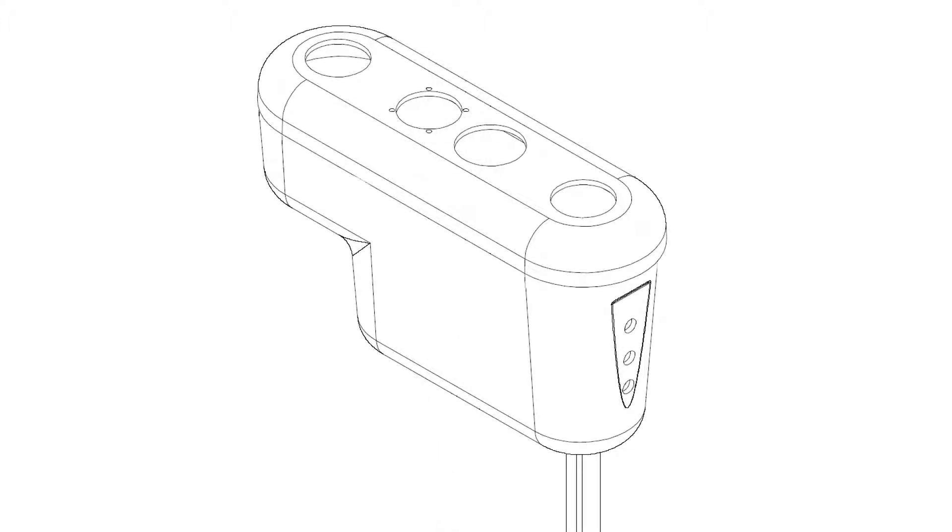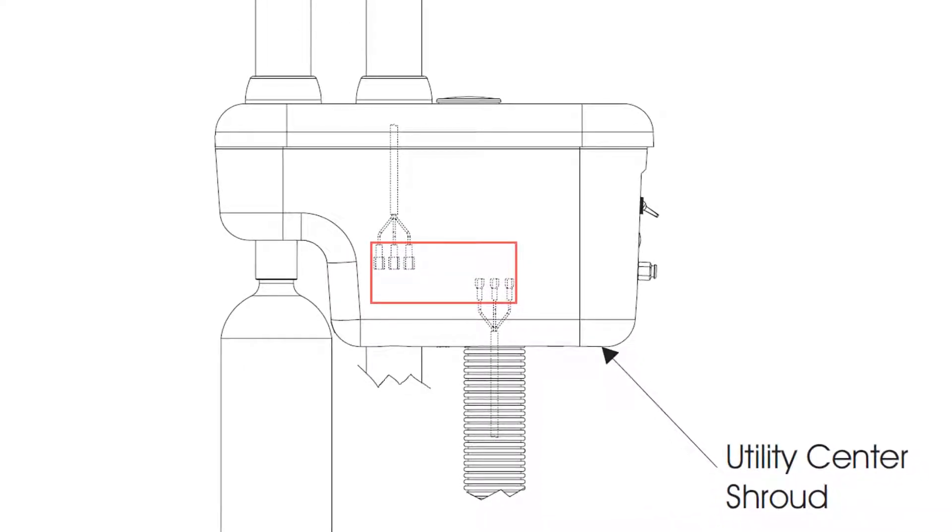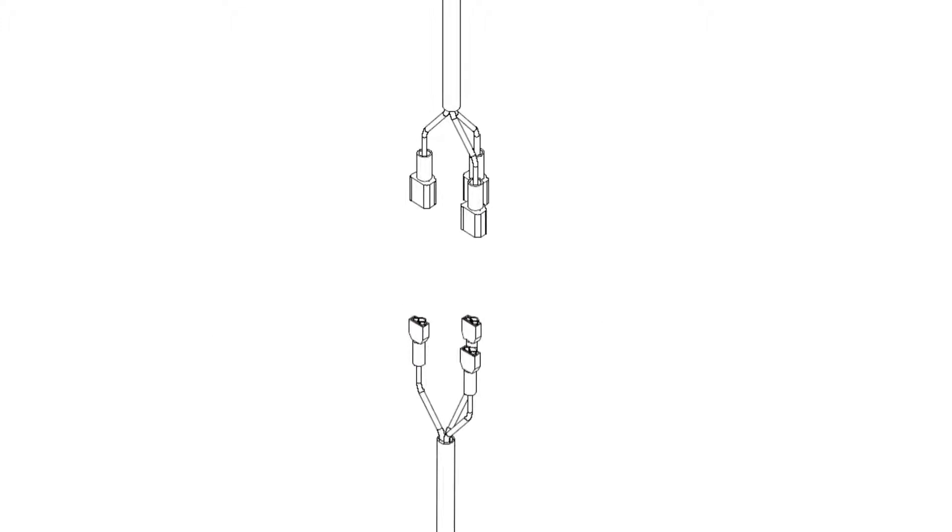For Ingle 310 and 320 packages, remove the 4 acorn nuts located under the utility center shroud, then pull the shroud down. Disconnect the light wiring harness by pulling the 3 mated spade connectors away from each other.